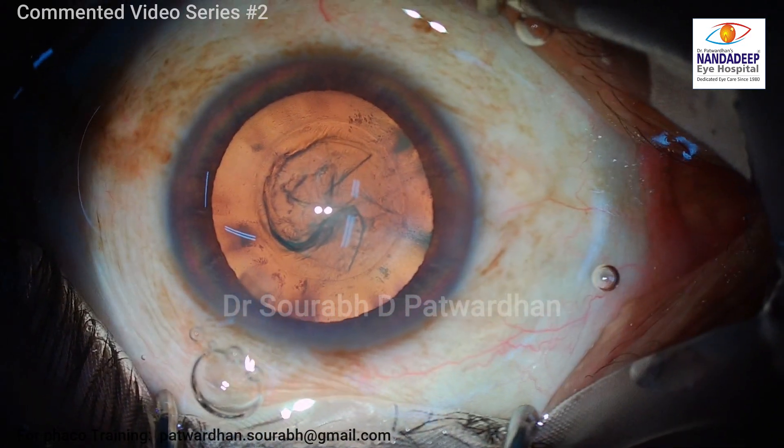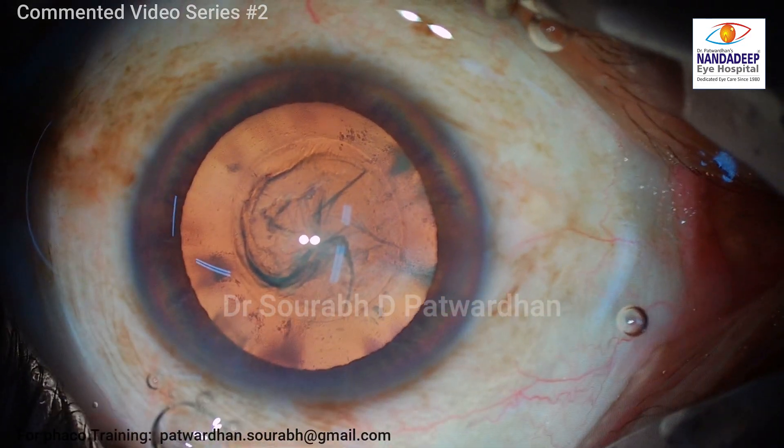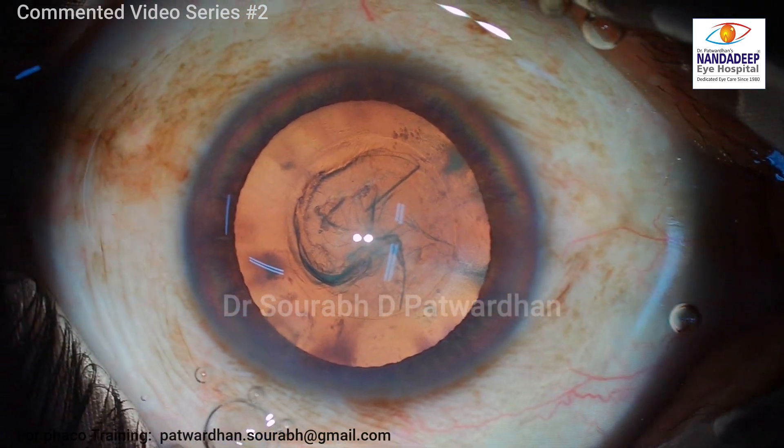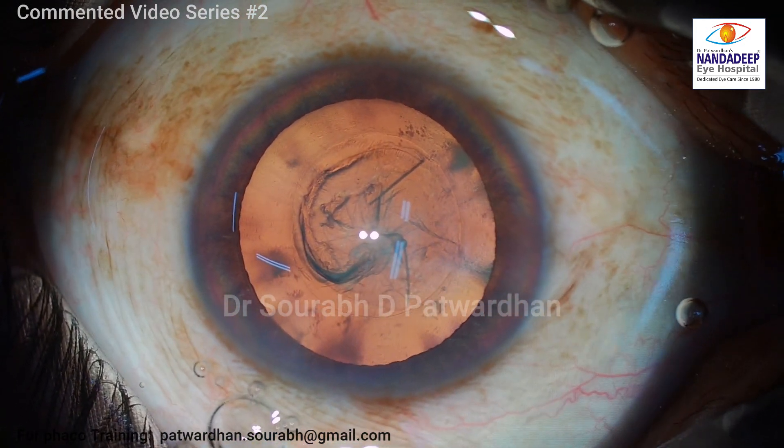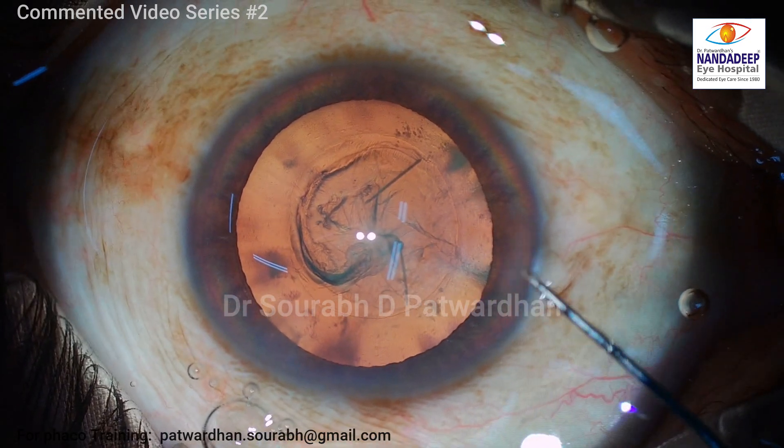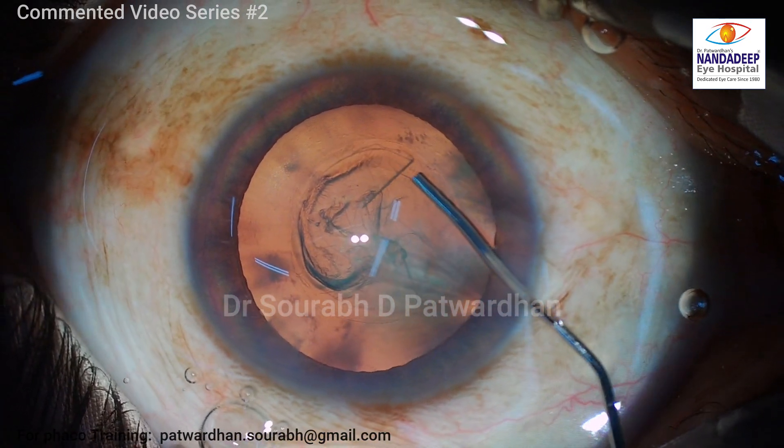The first few steps are just as usual. The side port was made, the 2.8 millimeter main clear corneal incision was made, and now I'm going to do the hydrodissection.